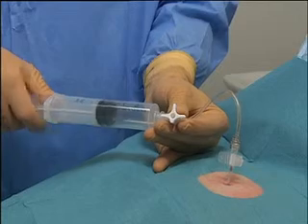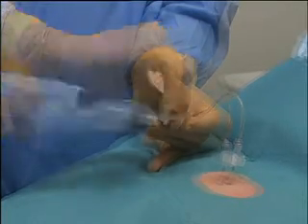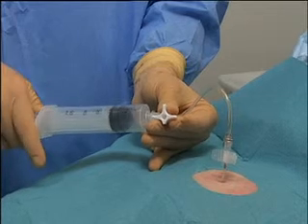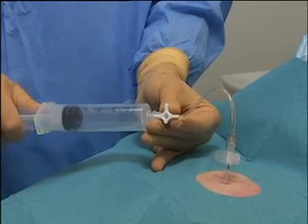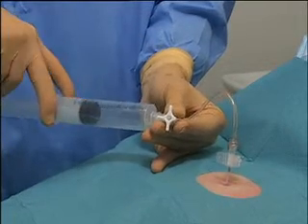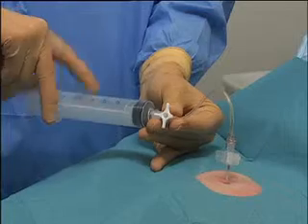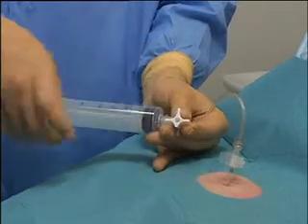Measure the volume of the air that is aspirated by counting the number of syringes evacuated. If more than 2.5 liters have been evacuated, the procedure should probably be stopped, because such a large volume suggests that there is an air leak. Continue manual aspiration until you cannot aspirate any more air.